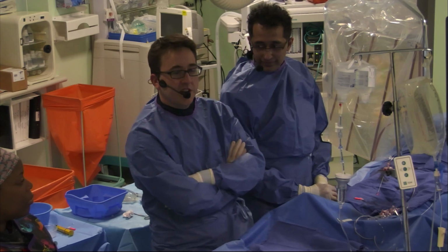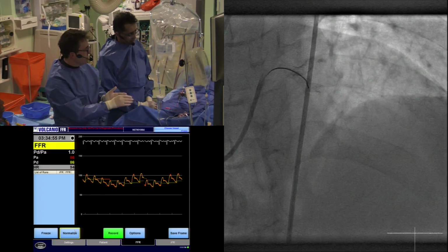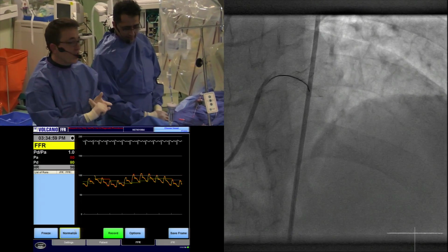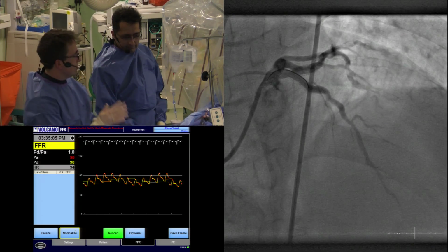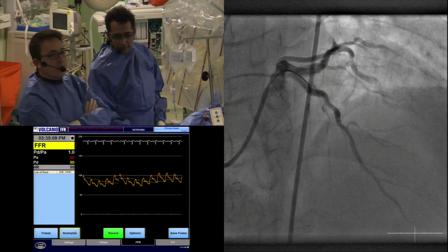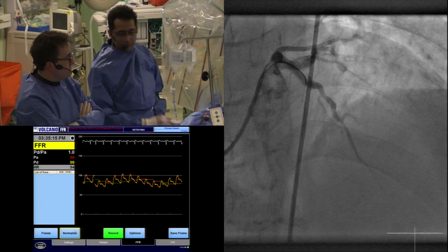Okay, so essentially, to make quality physiology measurements, you need to ensure that you're rigid with your methodology. So always normalising, always giving nitrates, and essentially having a good understanding, if you see a little bump on the pressure trace, or as we saw in that case that the value was higher than 1, to understand why it happens. I think that's absolutely right, and also be able to troubleshoot the machine. If there's a chatter, I mean, luckily we've seen that chatter and see how easy it is to resolve as well, just by small movements of the wire.